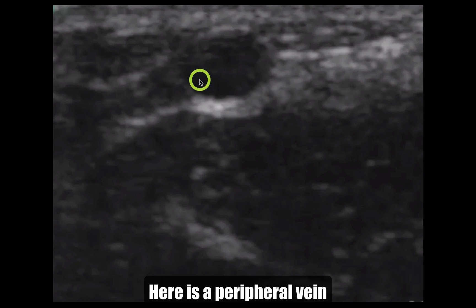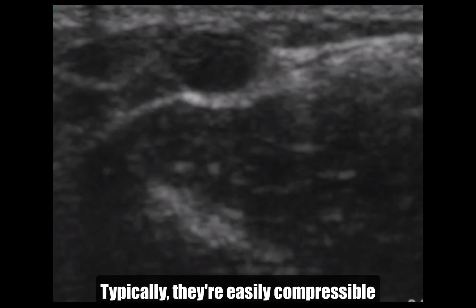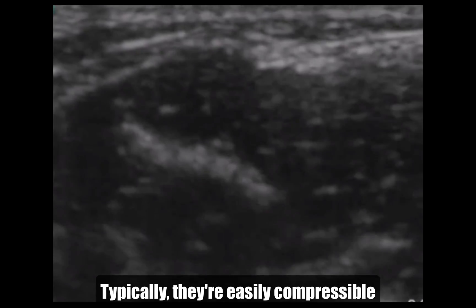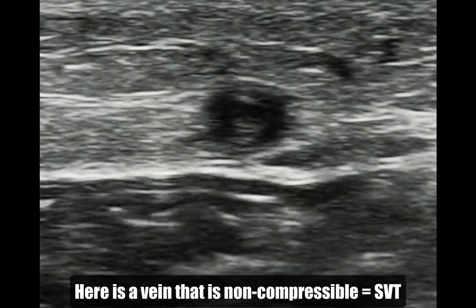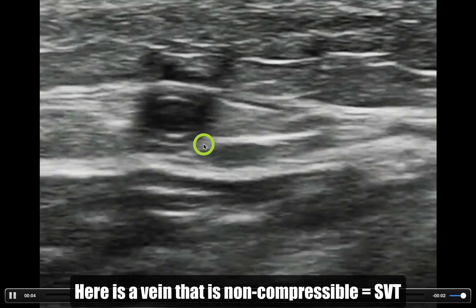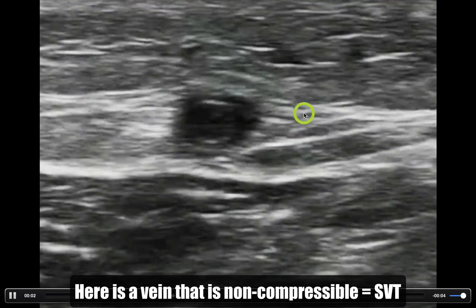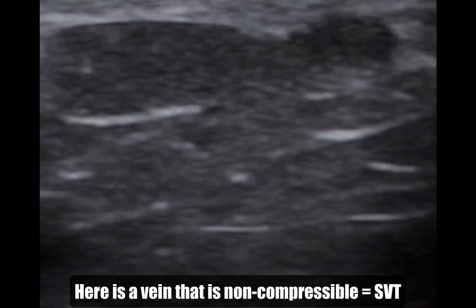This is a normal vein — when you apply a little pressure, it compresses 100%, just flattens completely. This is not that. Here's the greater saphenous vein; you can see it is non-compressible, and there is echogenic material within it. It's not compressible. This is what an SVT looks like.